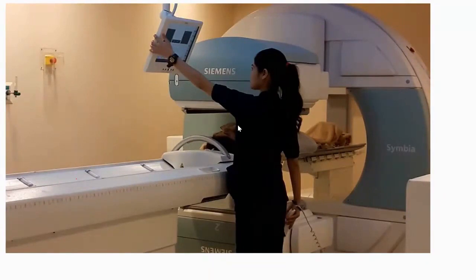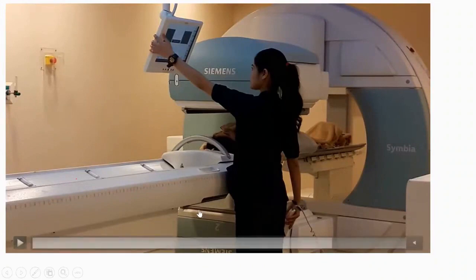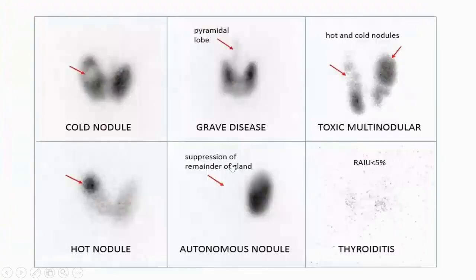For instance, a patient might be delayed in the process. After injecting the patient with a dose, for example, in the thyroid, they might be brought in after half an hour. You might have many cases, and this patient could come in after 4 or 5 hours. So what will happen to the activity? It will decrease due to the washout from the patient, leading to a lower count. Therefore, you will have to increase the scan time instead of redoing the patient. To compensate, you need to increase the sensitivity or the collected counts to provide an appropriate image quality.